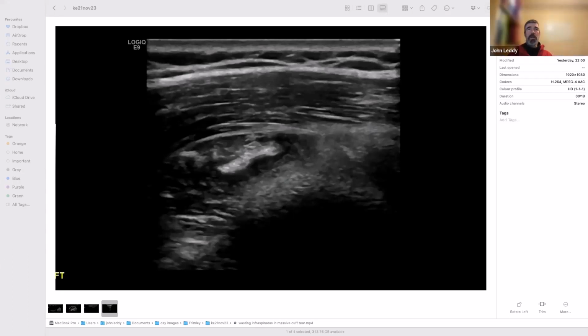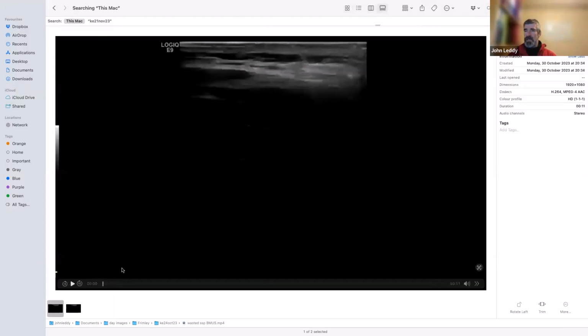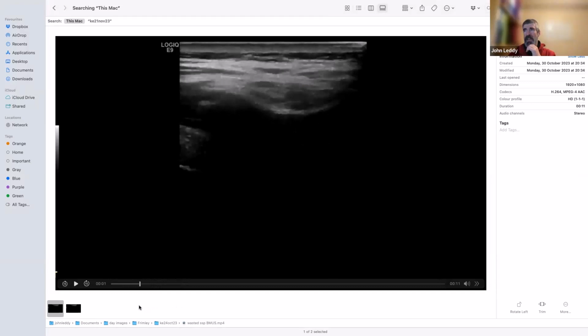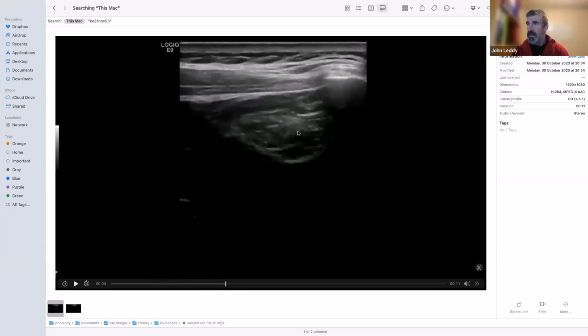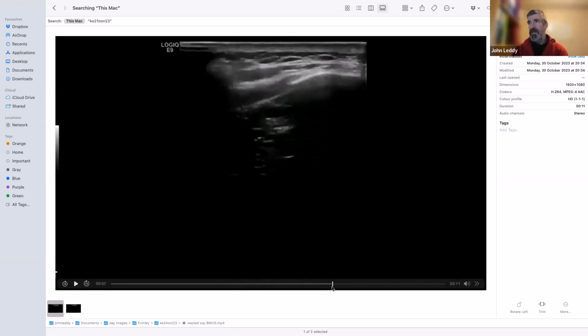I look for, if we go to the supraspinatus muscle on the big screen, this is a very dark picture. This is a wasted supraspinatus. So in my standard scan, I start right at the medial scapula, and I come down it like this, and I'm looking at the quality of the muscle, the amount of muscle in there as we come down, and the amount of fat.